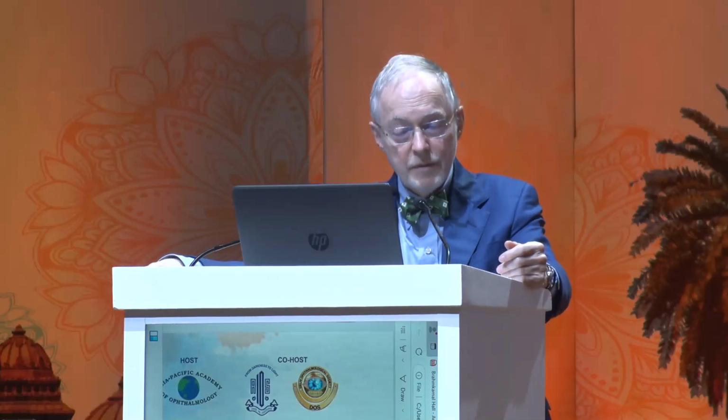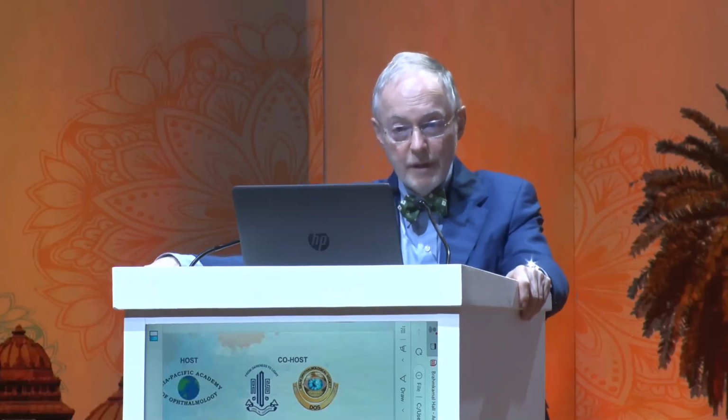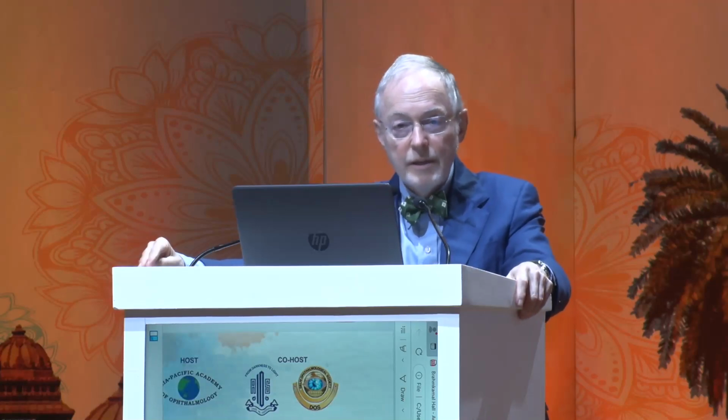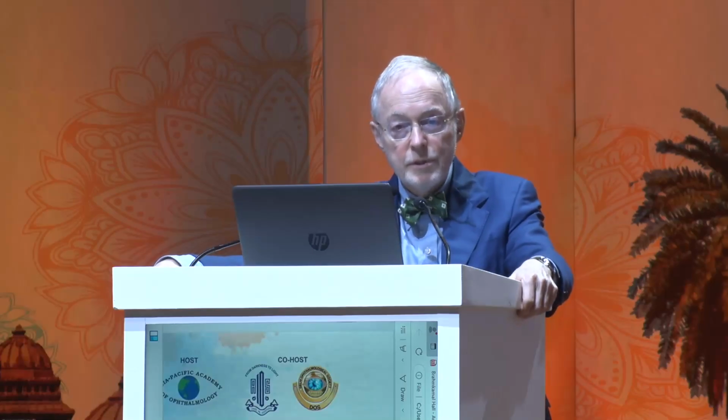After hyperopic LASIK, most corneas have about zero asphericity, but for something like that, they're probably going to have negative asphericity, so you might want to use a lens that has zero asphericity. But I would be very prepared to do an IOL exchange. Do your hyperopic LASIK calculation and tell the patient you've got maybe a 1 in 10 chance of needing an IOL exchange to get the most accuracy.